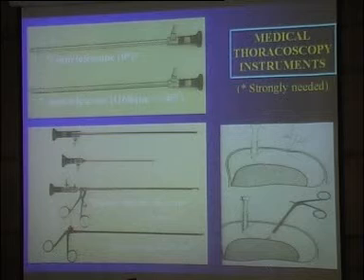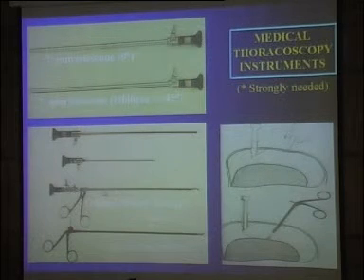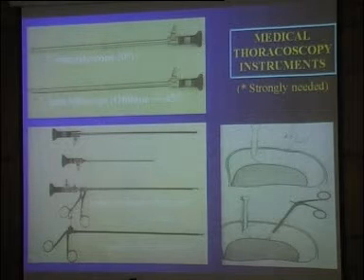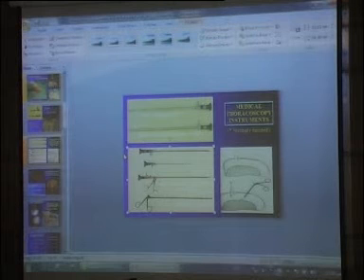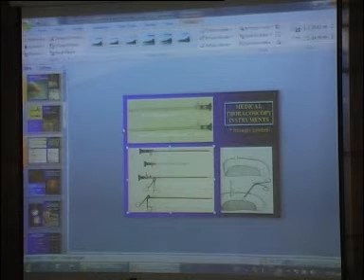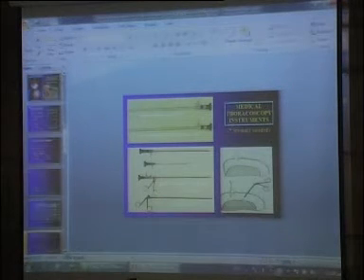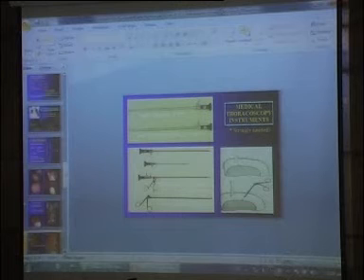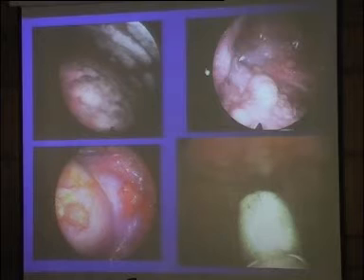The forceps is made of two pieces, and you put inside a 4 mm telescope, and then you can see what's happened. Okay? No, I think we have a tool from the Storz company, right? There is no optical biopsy forceps, but there is a working channel to put a forceps inside. If you have the Storz device, you can. I don't use it, but I know. There is a working channel you can put through.